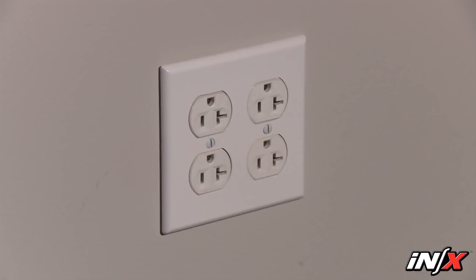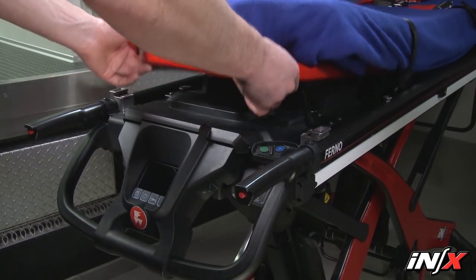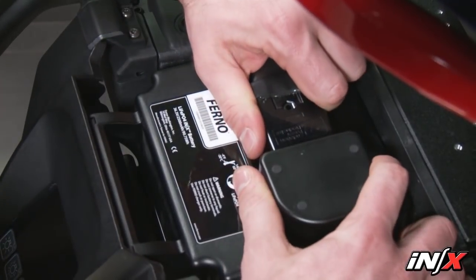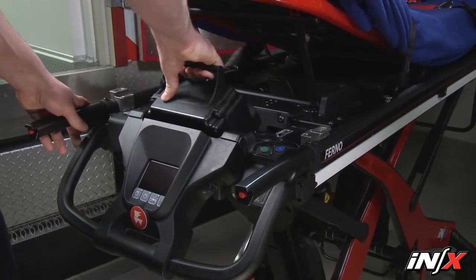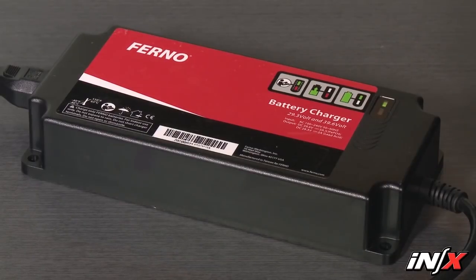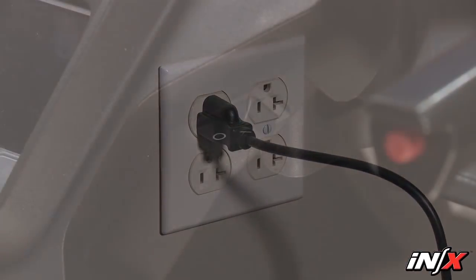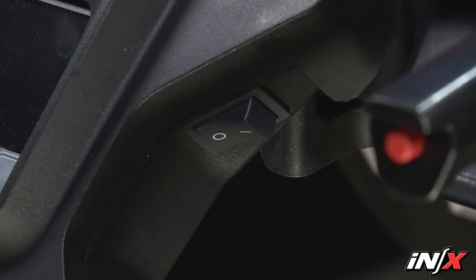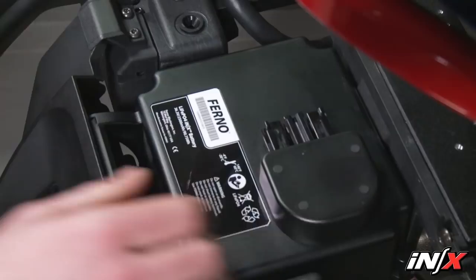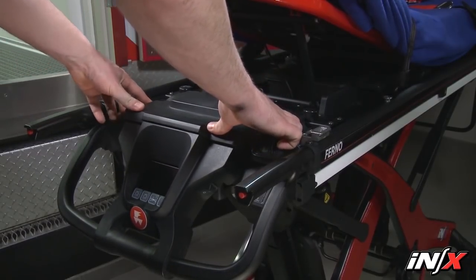To charge the battery through a household electric outlet, make sure the NX power switch is in the off position. Remove the battery by lifting the shock frame and removing the battery cover. Grasp the battery cable plug and disconnect it from the battery port. Use the battery carry handle to lift the battery away from the cradle, then connect the battery adapter cable and battery charger to the NX battery. Connect the battery charger to an electric outlet. To reconnect the battery, verify the power switch is off, raise the shock frame, angle and slide the battery into the cradle, press down to secure it, connect the cable plug to the battery port, replace the battery cover, and lower the shock frame.